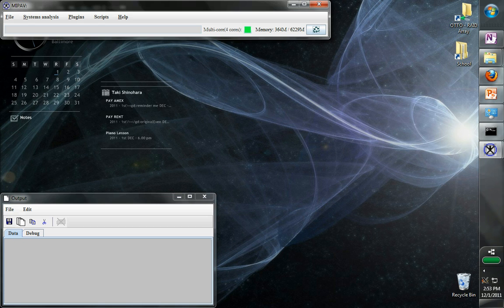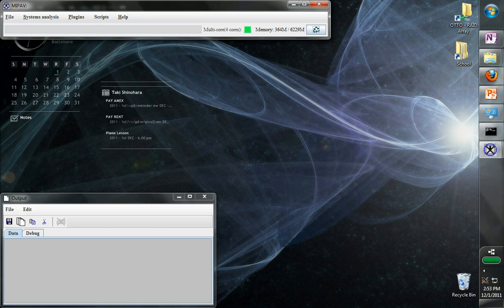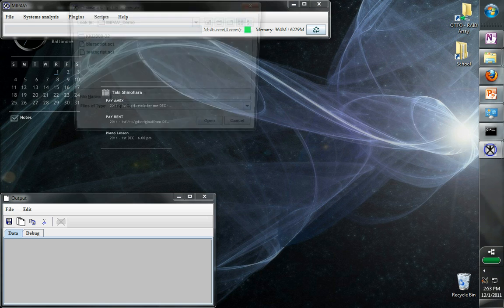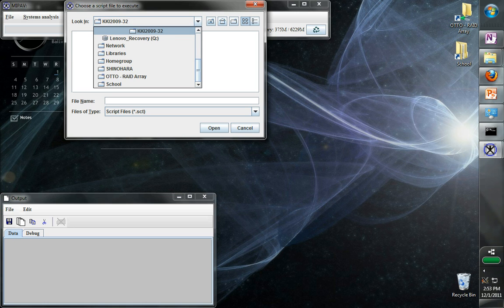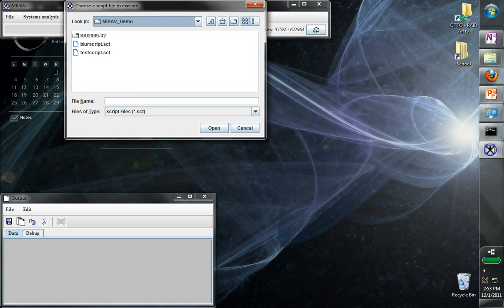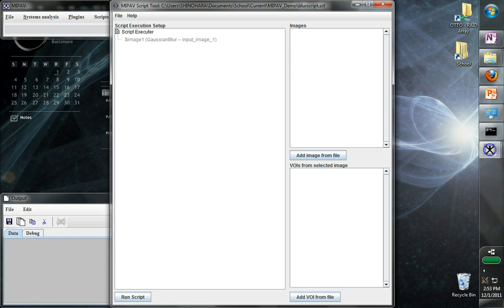So our next question is now that we have this script, will it work? Can we apply it to a couple of images? Well, to actually make MiPav do these steps, we can go to scripts, run script. We'll first select the script we're going to run here, and then that brings up the script tool.